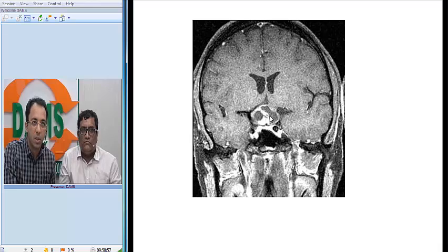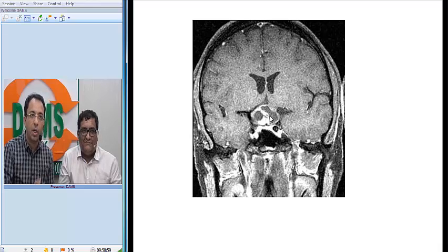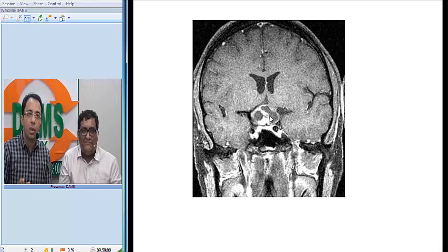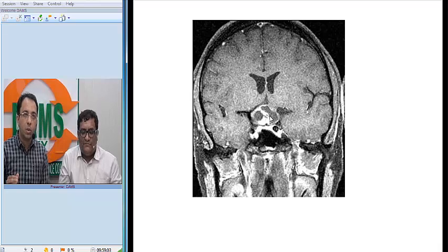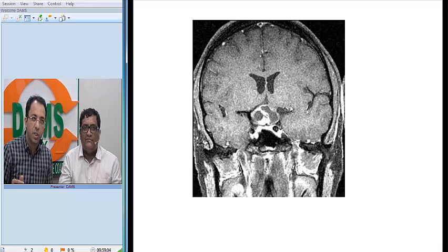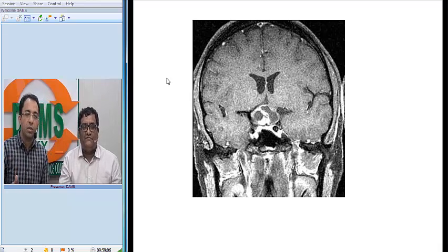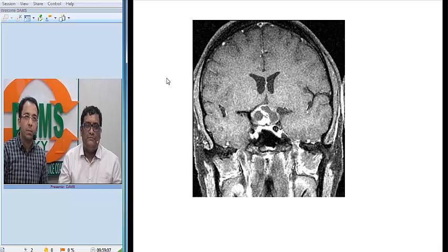The carotid artery flow voids are visible, separate from the tumour. The diagnosis, as many of you could already make out, is craniopharyngioma. I will now invite Dr. Sanjeev to discuss the histological and pathological findings of the same tumour.